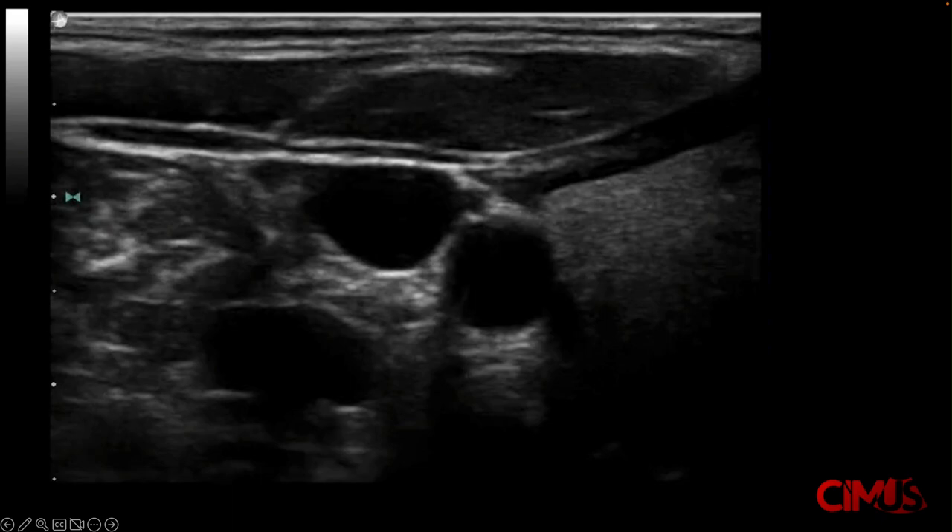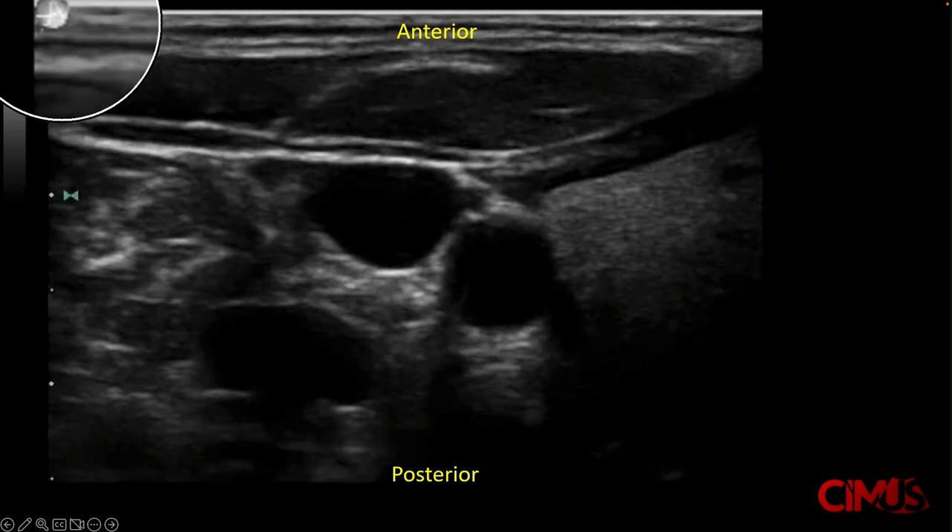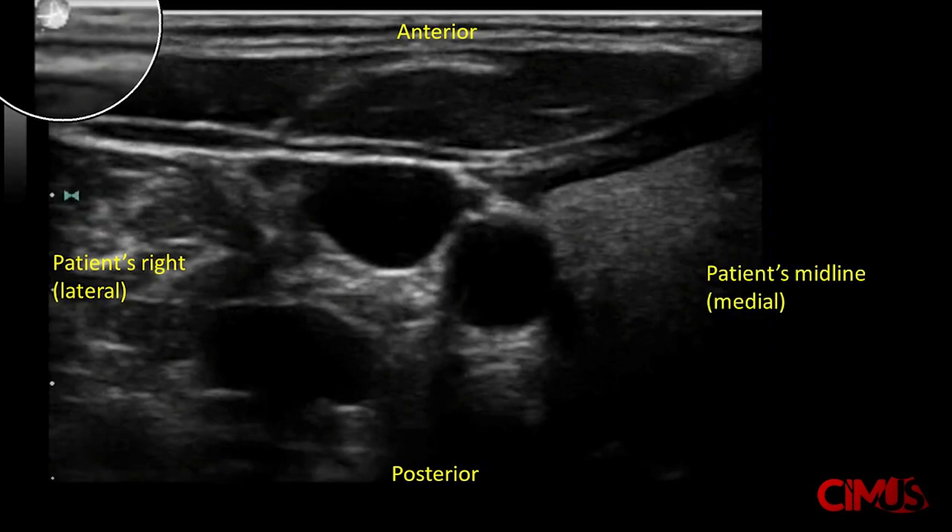The ultrasound image looks something like this. The near field, or top of the screen, is the anterior aspect of the patient. The far field is the posterior. As the transducer marker is pointing to the patient's right, which corresponds to the dot on the screen here, the screen left will correspond to the patient's right, while the screen right will be the patient's left, or close to the patient's midline. This image is similar to the way CT scans are cut, as if we're looking up into the patient from the patient's feet.